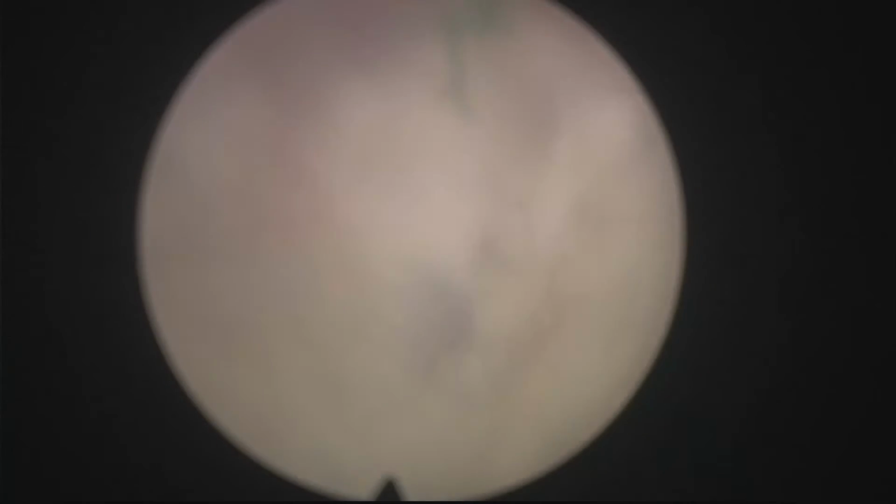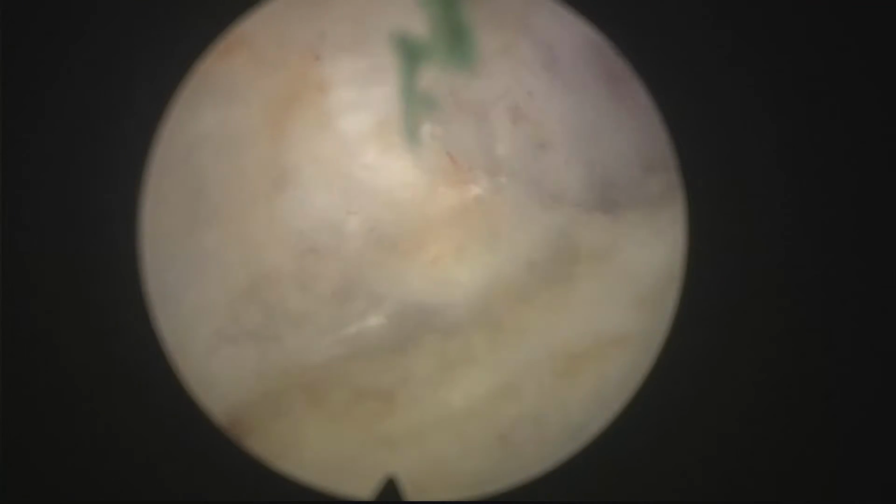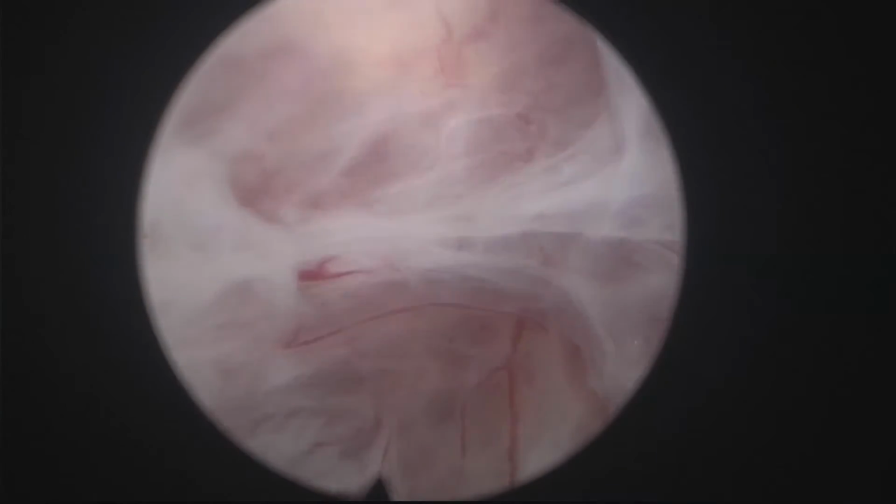But here, having had a previous TURP, there is a lot of fibrosis. Still, you can see that the energy is opening up the plane, just carefully checking that it's the proper plane or very near to it. Also, another very nice aspect of pulse modulation is the nice first pass hemostasis, which allows to do a very nice operation.